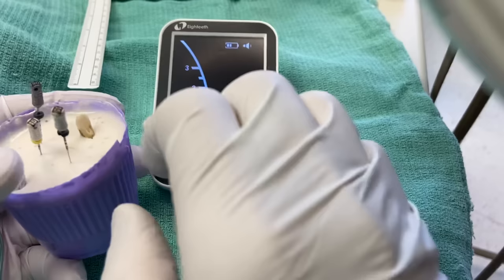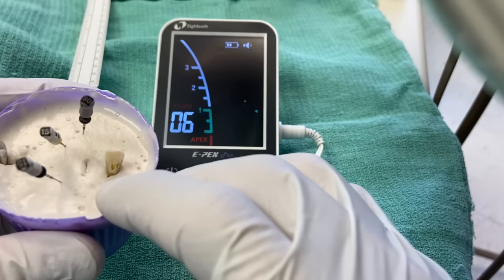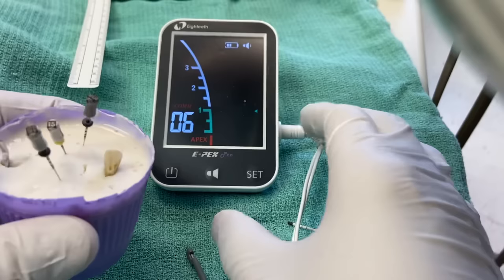Hey, Asher Building Dentistry — the place where we're passionate about sharing those unwritten hints. These might be written, but let's go ahead and review them because they can be really frustrating. We've got a tooth in alginate, and we're just practicing our access, cleaning, and shaping.